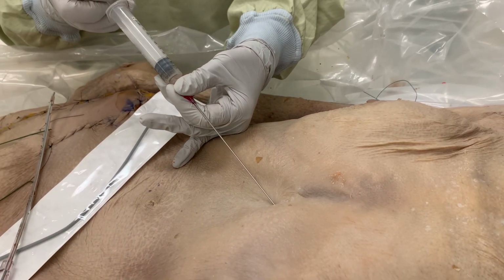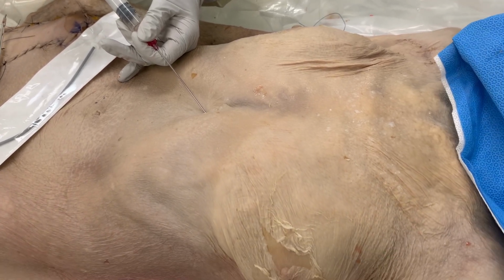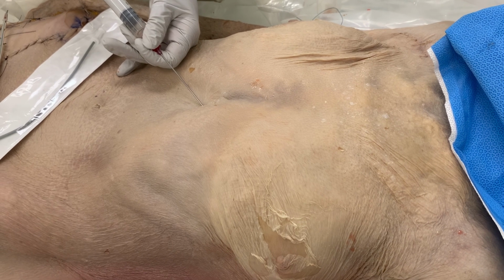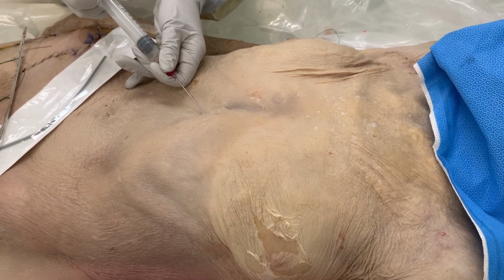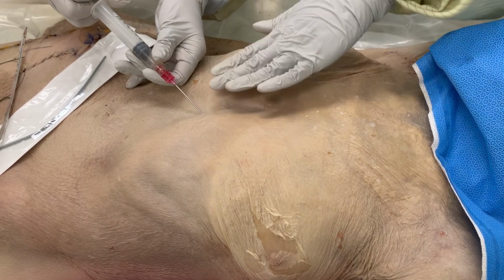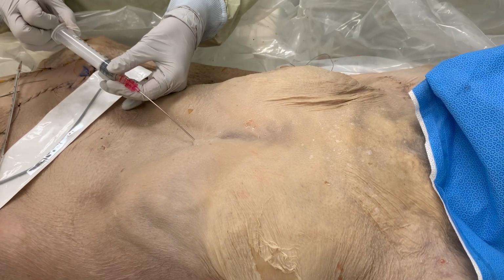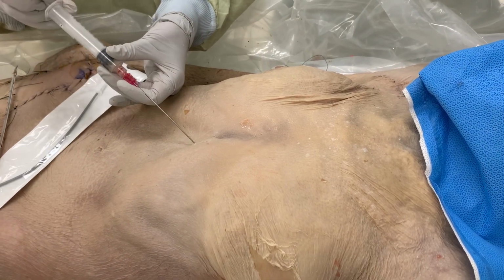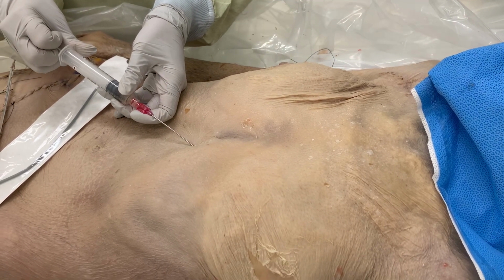A large bore 20 gauge or larger needle of sufficient length is then inserted into the subxiphoid region, 1 to 2 centimeters below the xiphoid process and between the inferior costal margin. Angle the needle under the ribcage no more than 20 to 30 degrees to the patient's skin and aim the needle towards the patient's left shoulder as you continuously aspirate the syringe.